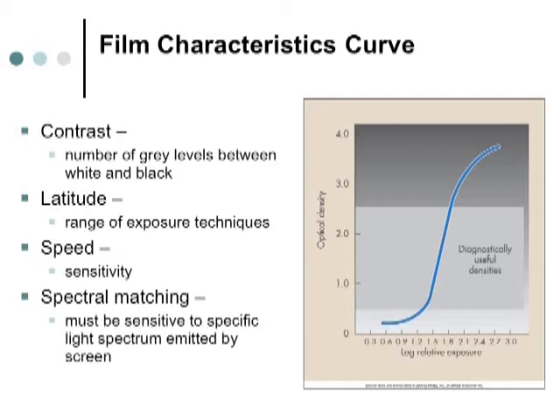Now here's the bad part. The film's recording 100 to 1,000 shades of gray. How many can we see? Only about 30. The scale of gray that we're actually able to visualize is only about 30 shades of gray on a particular film. So the H&D curve is going to be between 0.25 and 3.0. Now this is going to become important when we talk about digital later on.